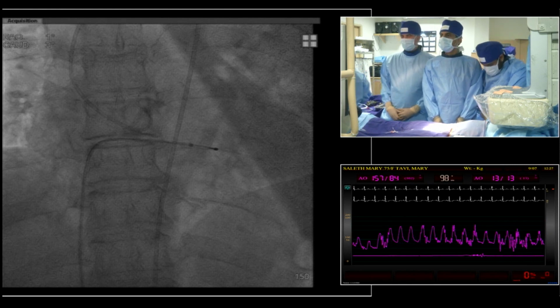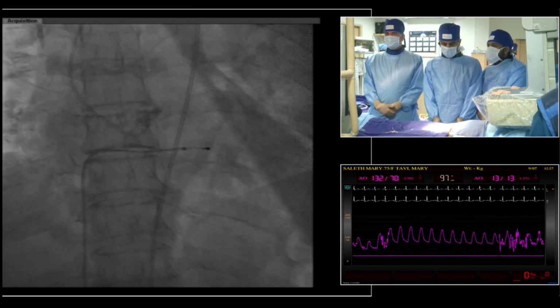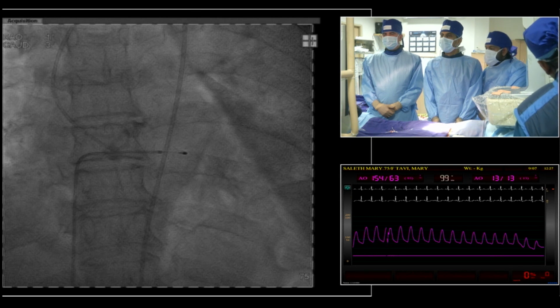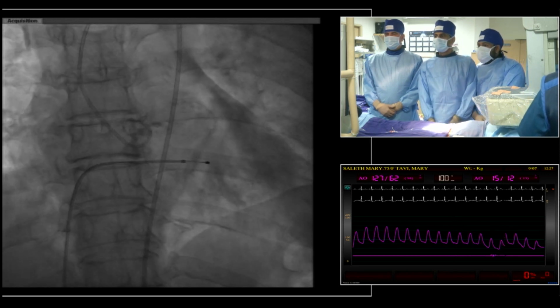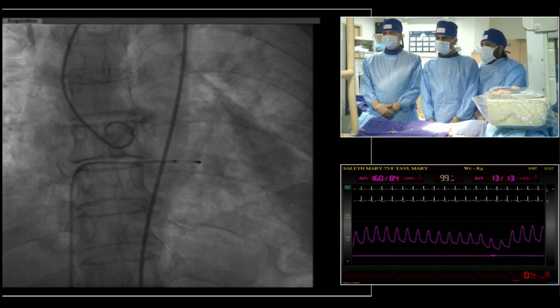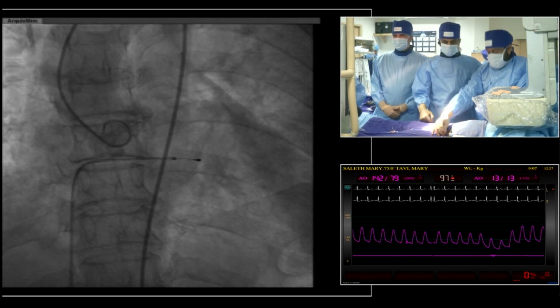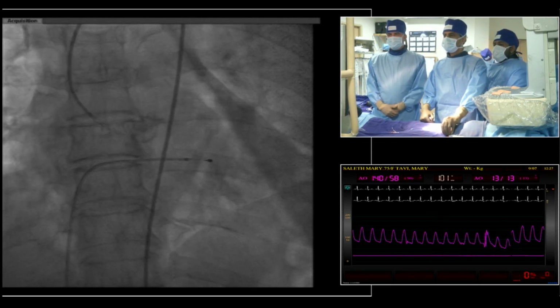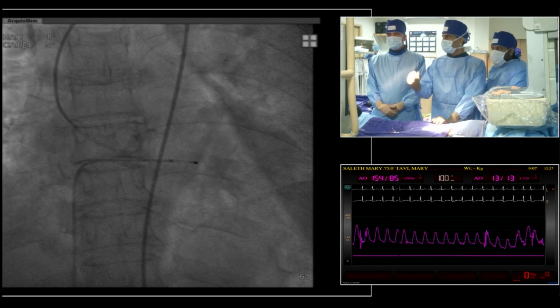Maybe we can discuss the importance of the coplanar view. There will be some patients where we cannot do a percutaneous access, and we have to identify those cases. Those will be the patients where the calcification is anterior in the femoral arteries, or there is more than 180-degree calcification. In these patients, typically we start thinking of an open surgical approach, which is still used in about 15-20%.